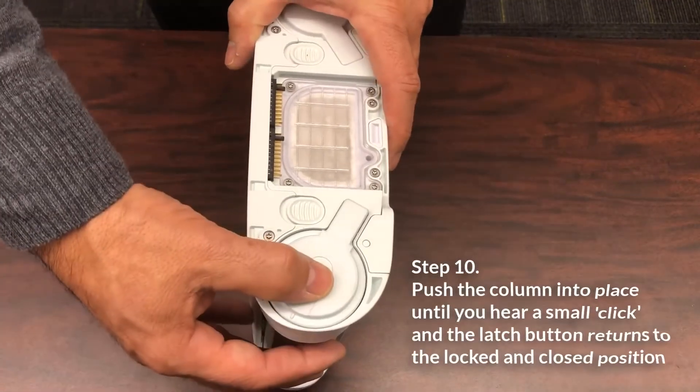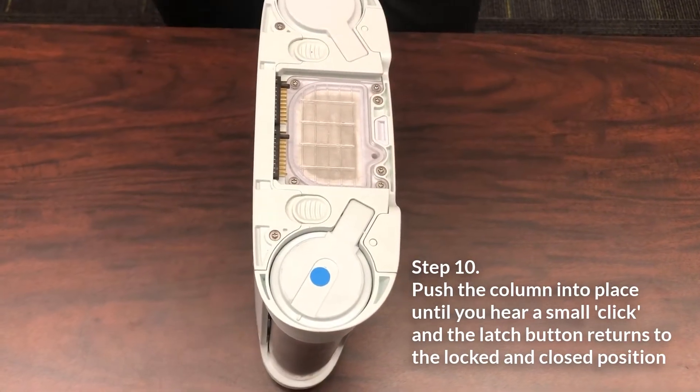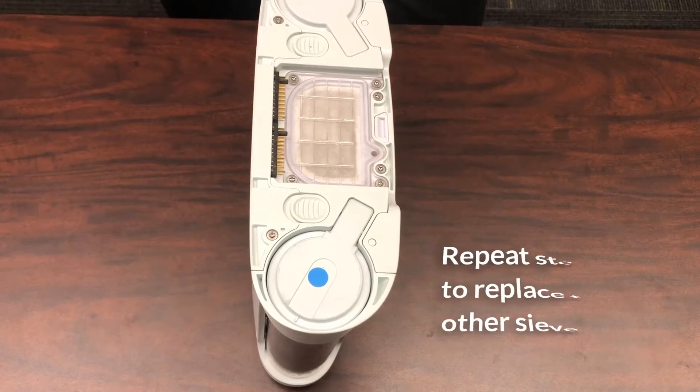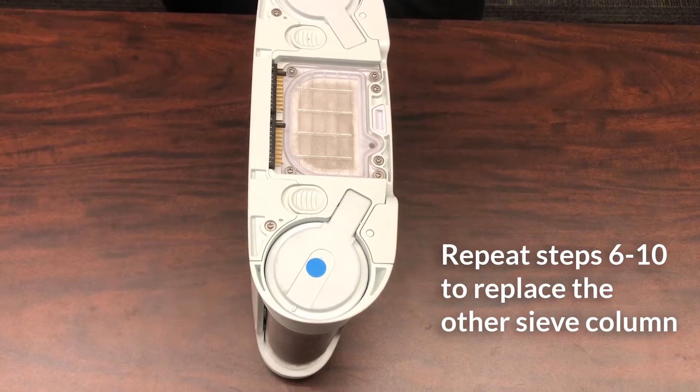Push the column into the device so that the column is fully seated into the concentrator. The spring-loaded latch button should fully return to the locked and closed position. Then repeat steps 6 through 10 to replace the other sieve column before moving forward.